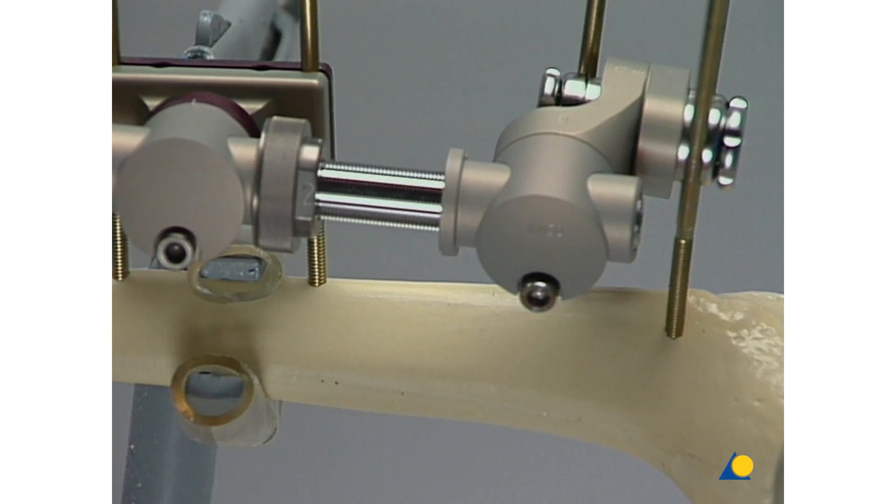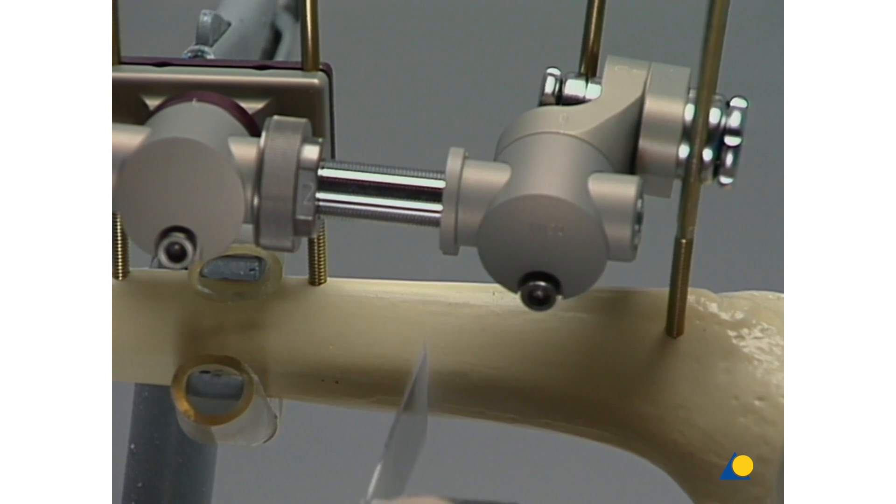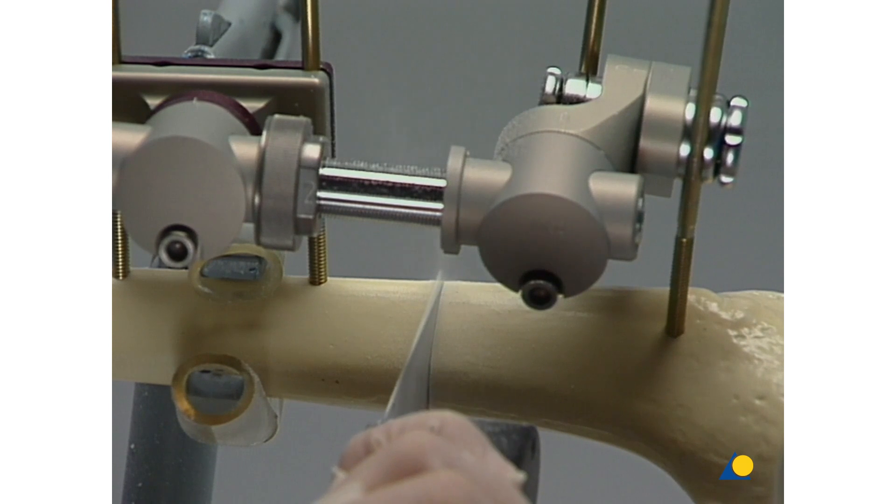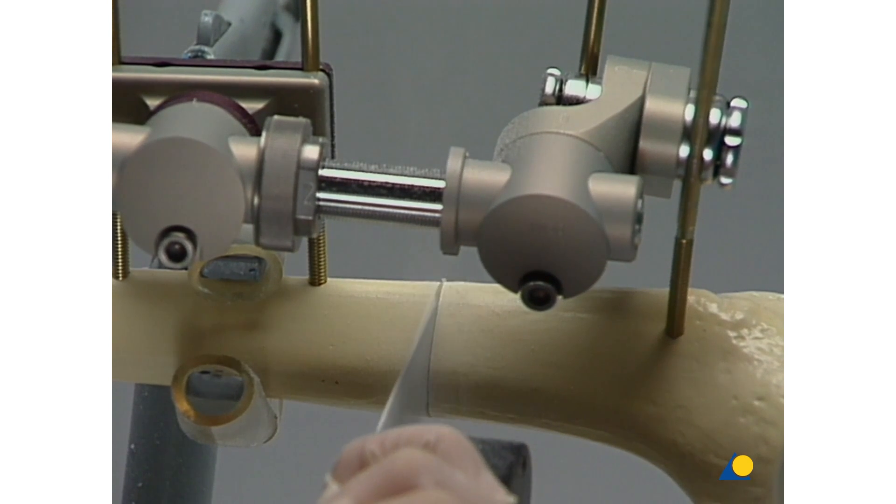The site of the corticotomy is shown on the proximal shaft, below the tibial head. In this exercise, the corticotomy is carried out with an oscillating saw, although it is clear that clinically a corticotomy is preferably performed with the corresponding chisels taking care of the surrounding tissue.